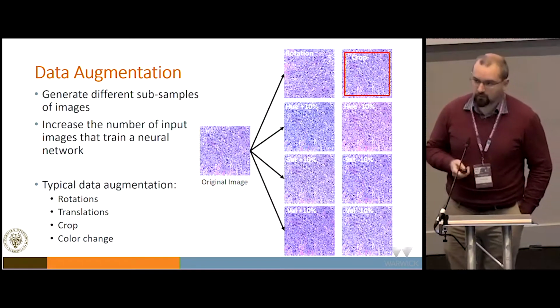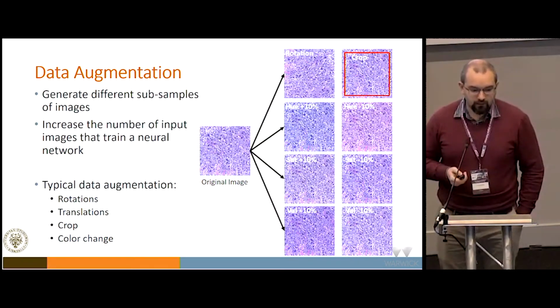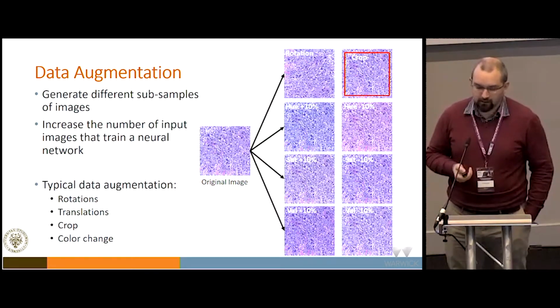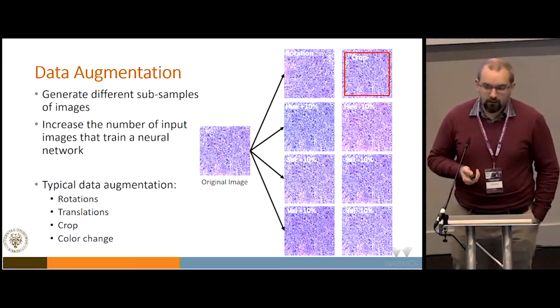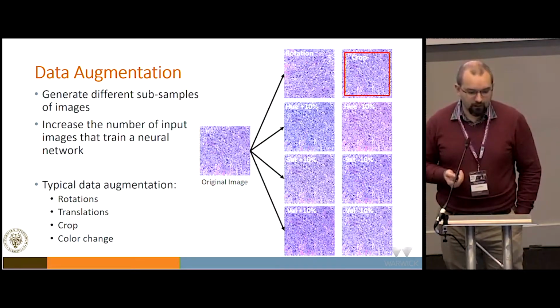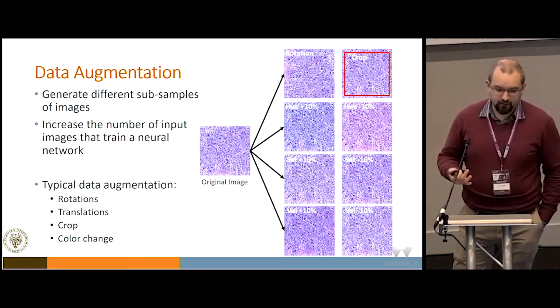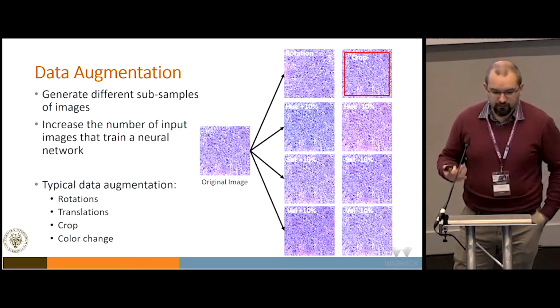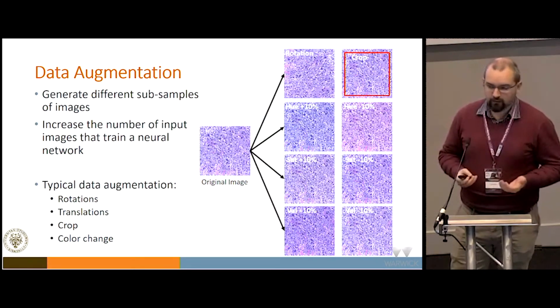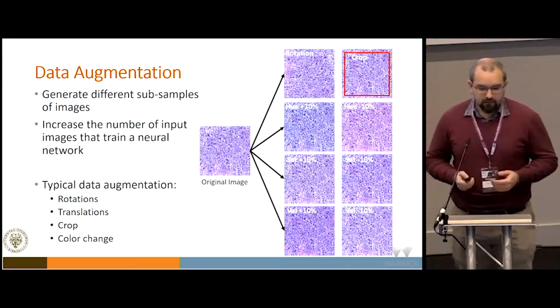As was pointed out before, one of the problems that we can face is a bias during training in a neural network. Therefore, we can think about creating synthetic images to augment the variability of the images that our neural network can handle, using different methods.